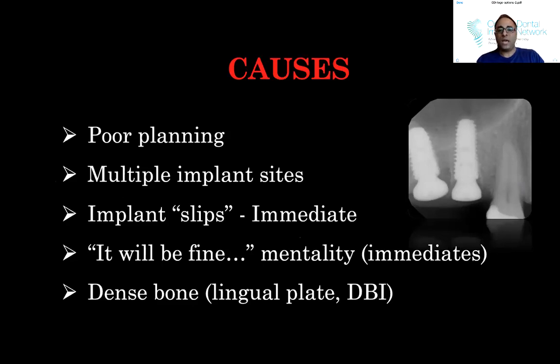Or sometimes it's the, hey, it'll be fine mentality, right? Like this case, I looked at it, I was like, yeah, it's going to be fine, but it really isn't fine. I should have corrected that, really. And there are certain times you can make corrections in the surgery. The best stage is at the guide pin stage. By the time you enlarge the site, it's really tough to make that correction. Dense bone islands will throw you off, right? They'll deflect your drills.